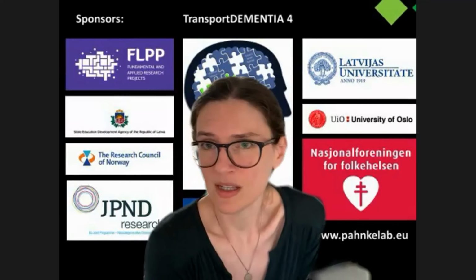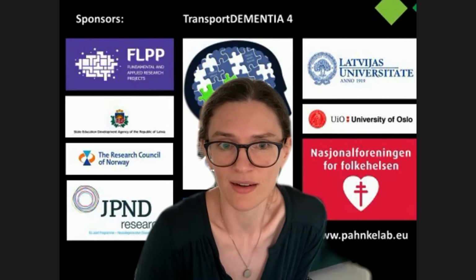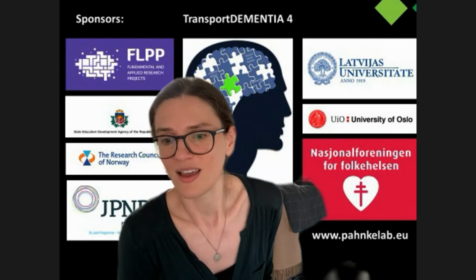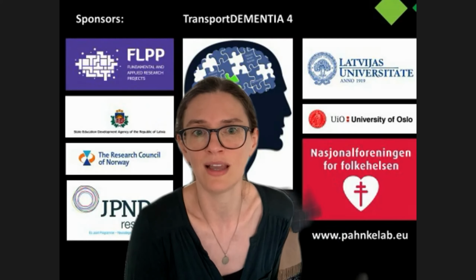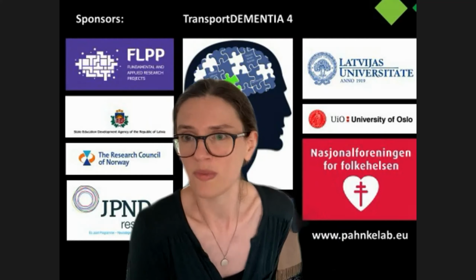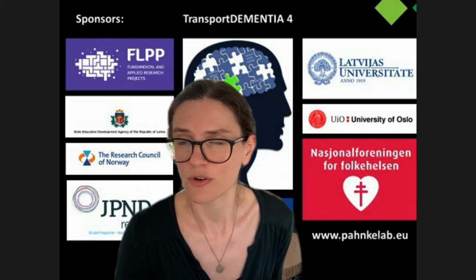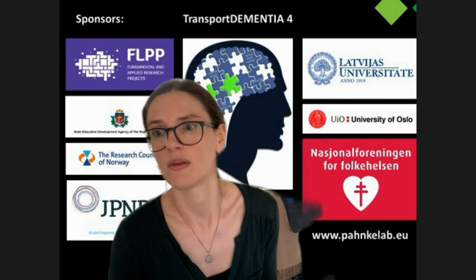I think what Stoyan meant is if we can influence which neuronal network is actually used, and we cannot. So this is predefined by the software, and the different modes that I showed you, they actually use different neural networks to perform their tasks. For example, the objects mode is using instance segmentation.